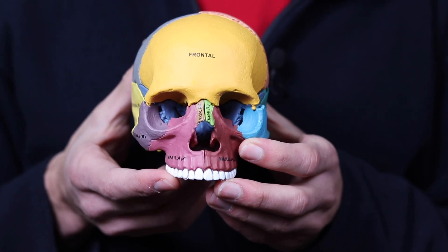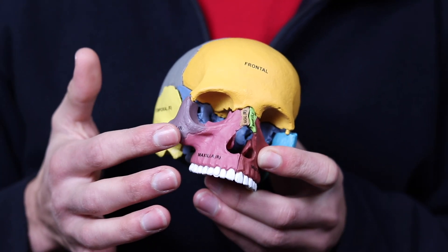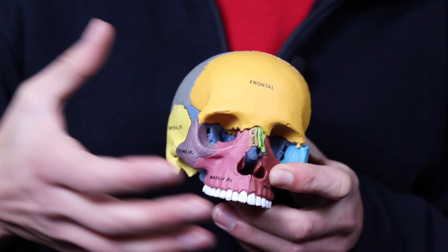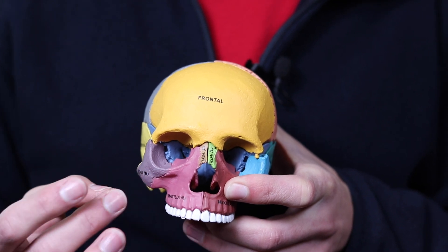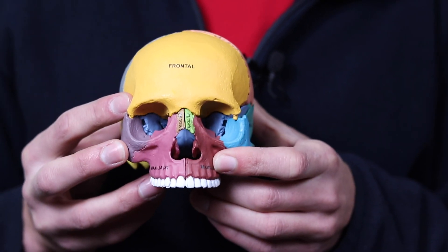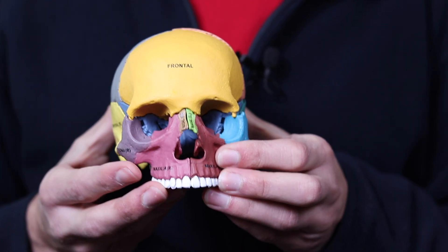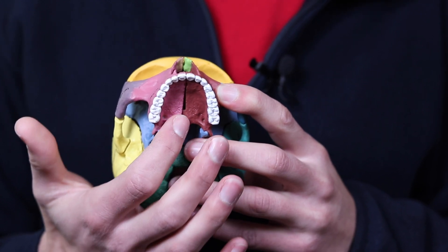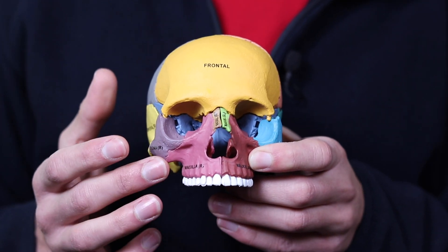One way they overcome this hurdle at a 100% success rate is to do the DOME procedure, which involves cutting here and cutting here. But when you do the DOME, it prevents mid-face expansion. The way the maxilla is connected to the cheekbone is through this suture, so if you cut this suture, the expansion force is not going to transfer to the cheekbone — the maxilla gets really wide yet the mid-face doesn't keep up. Although DOME guarantees a suture split of the mid-palatal suture, it makes mid-face expansion impossible. In my opinion, the better option is a cortical puncture, where the mid-palatal suture is punctured by the dentist's drill. This weakens the suture and gives you a better chance of a split while also leaving open the door to mid-face expansion.